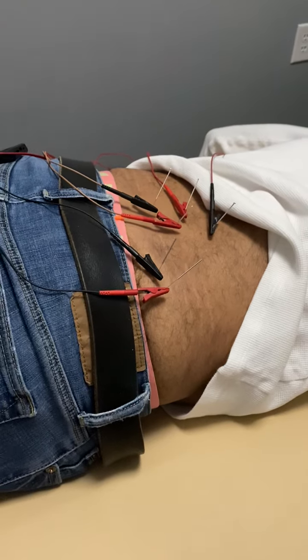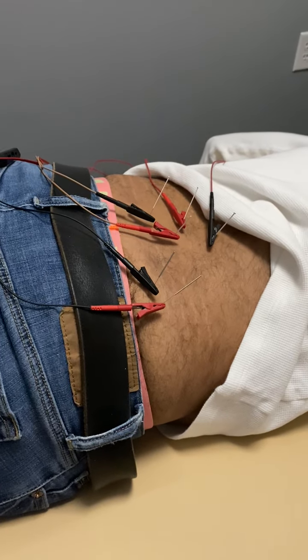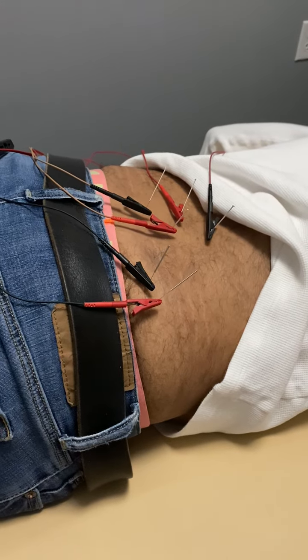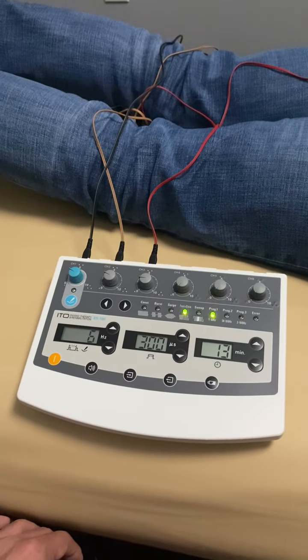This is going to allow us to cover much bigger areas and get a lot more efficacy. We all know from the data that when you add electrostim to acupuncture it makes it way more effective, and the same can be said for dry needling. It's a very simple, low-cost solution and we're excited to have it here.